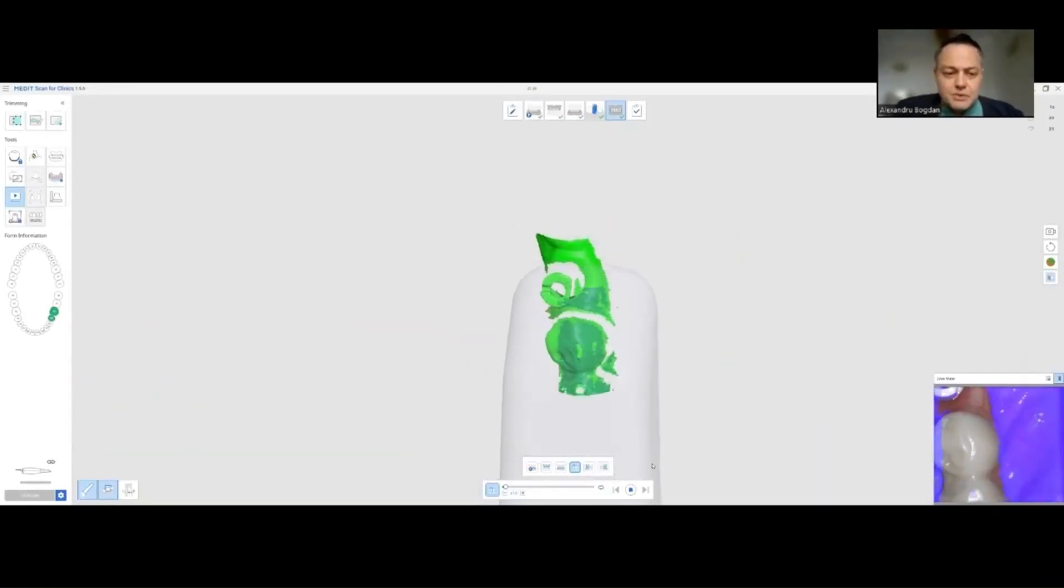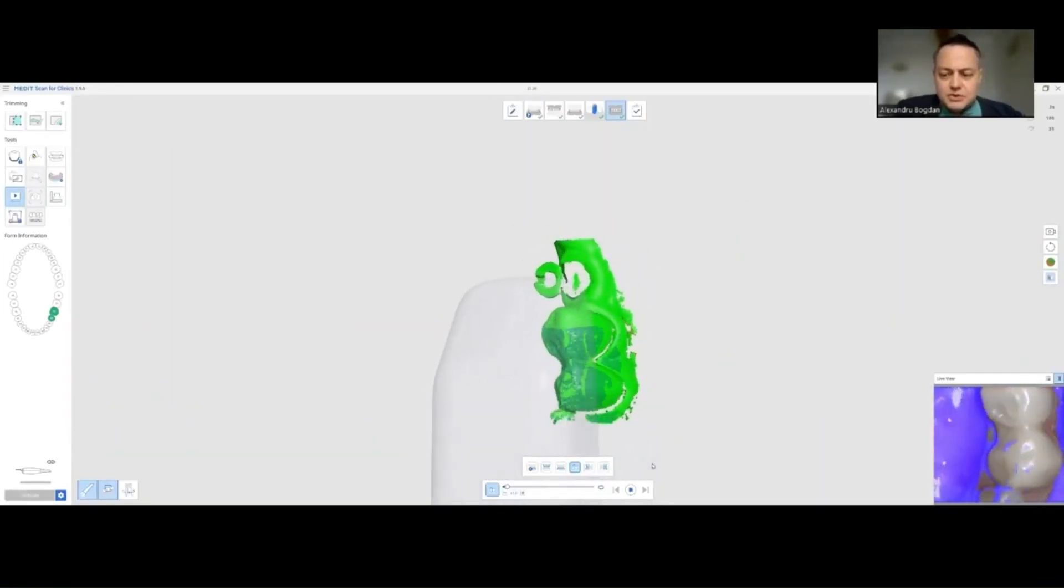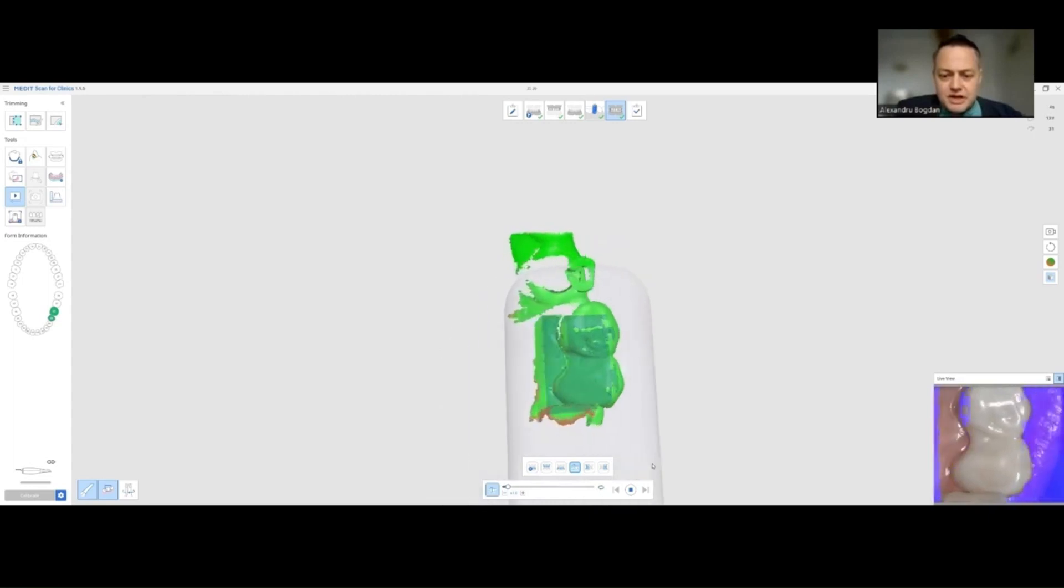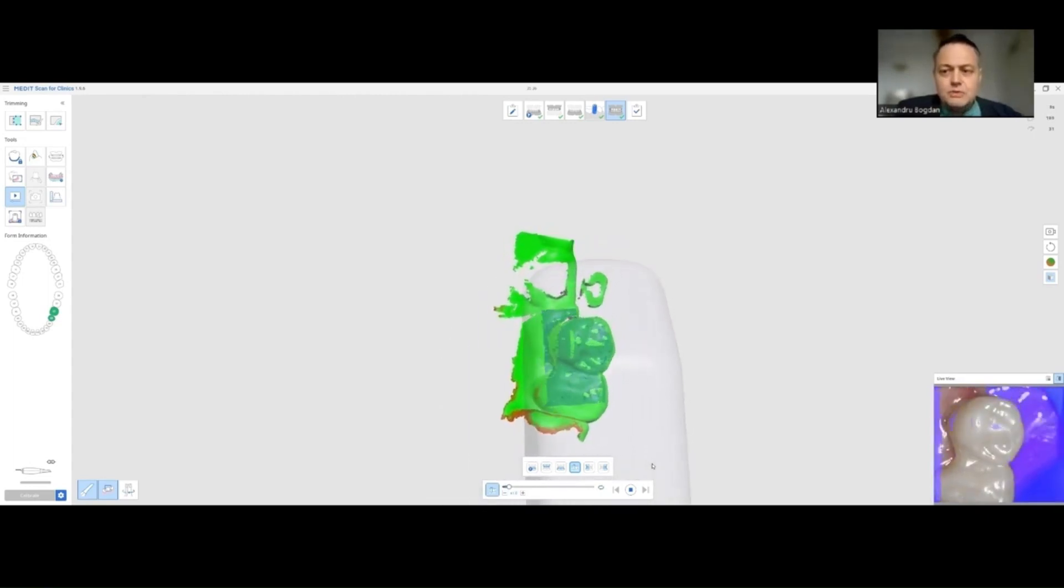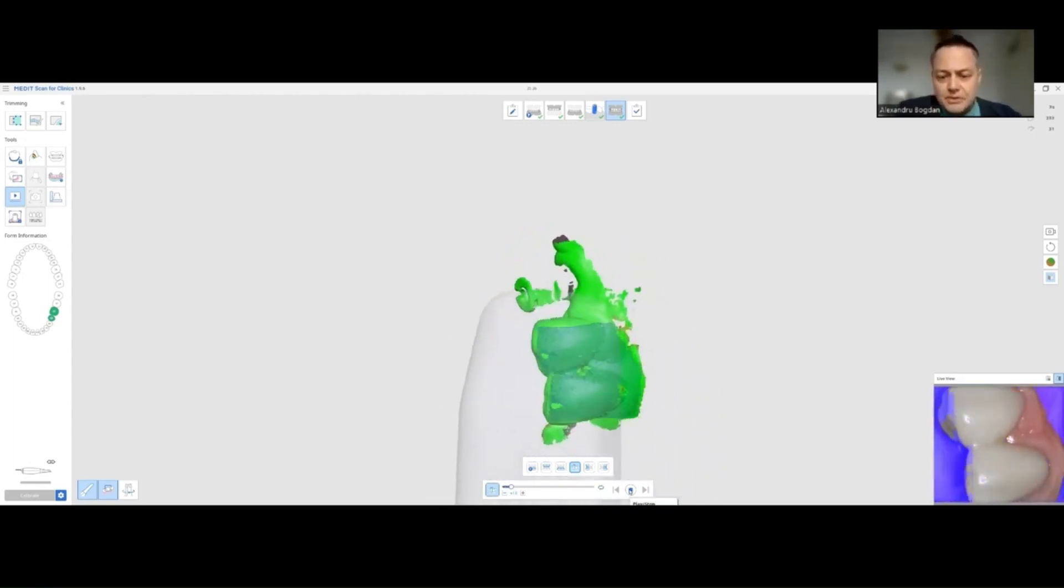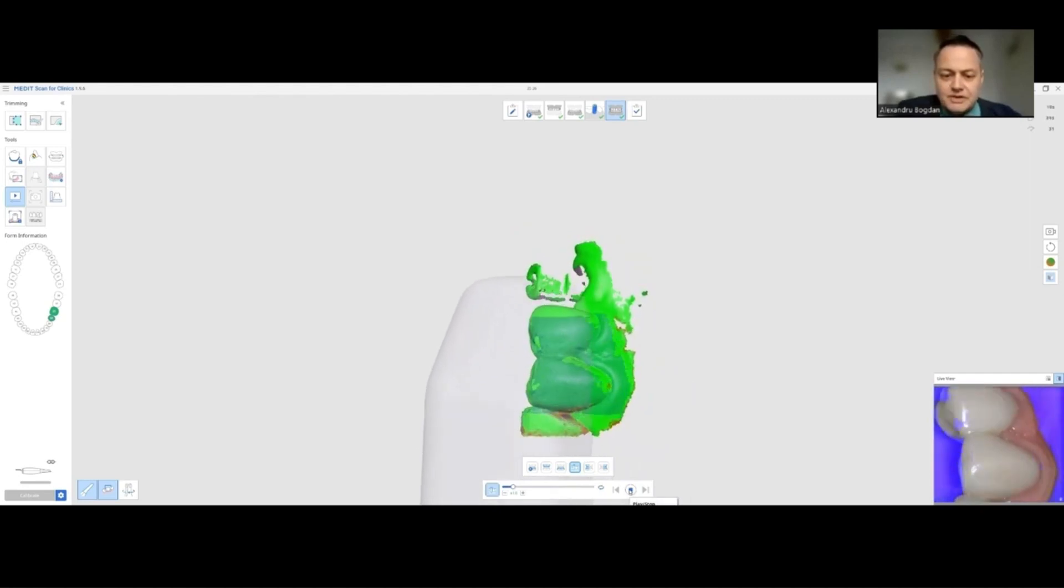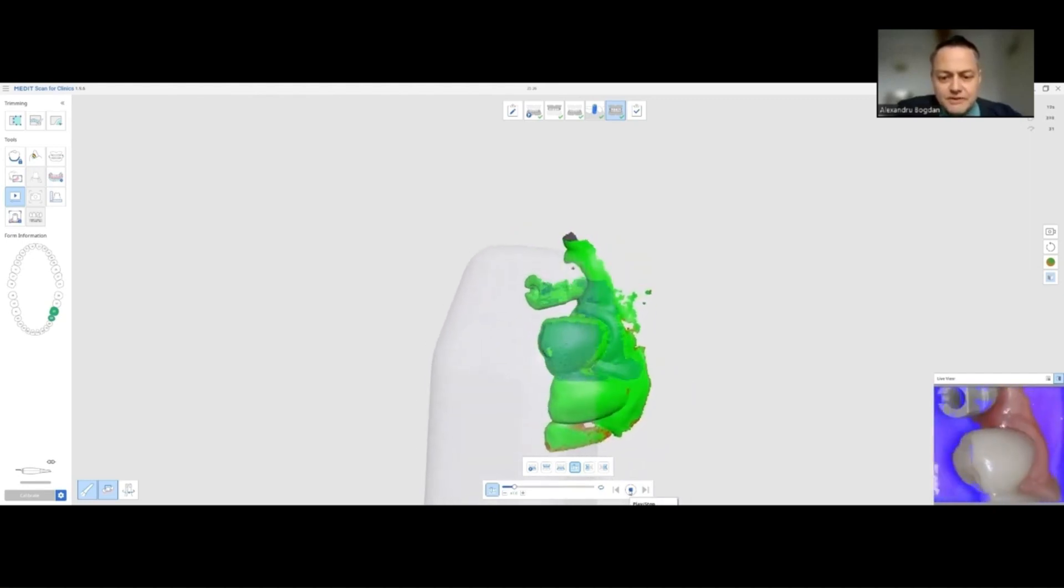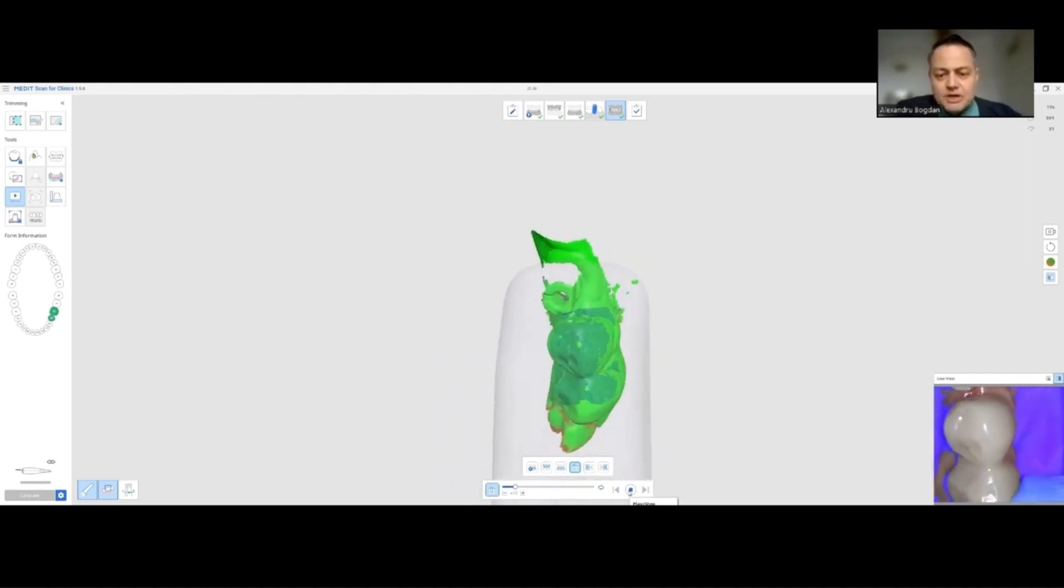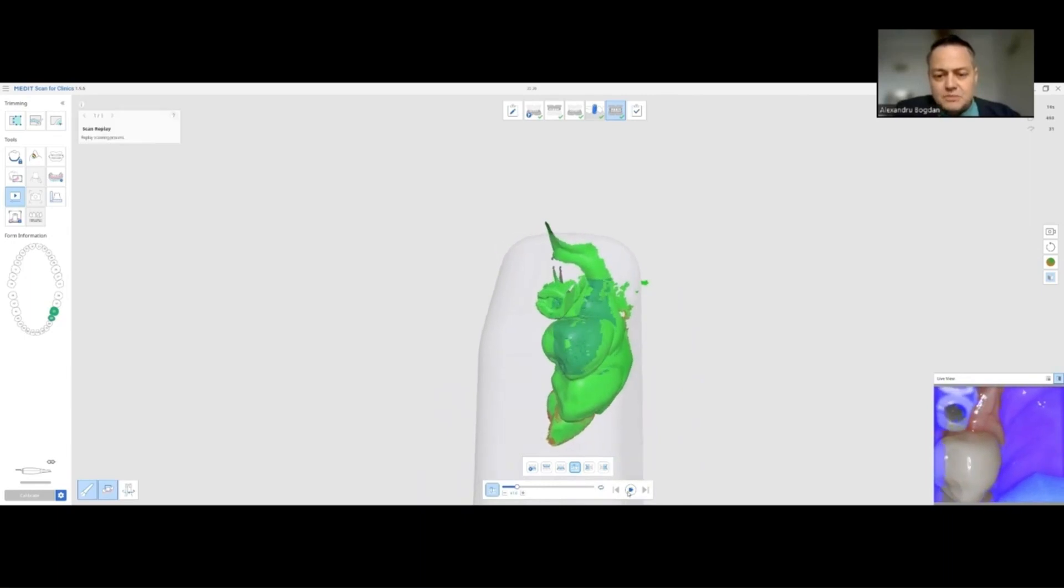First, we're going to scan the teeth surrounding the area and be sure we have a green mesh. Like you see here, I want these teeth to be as perfectly imaged as possible, green meshes.